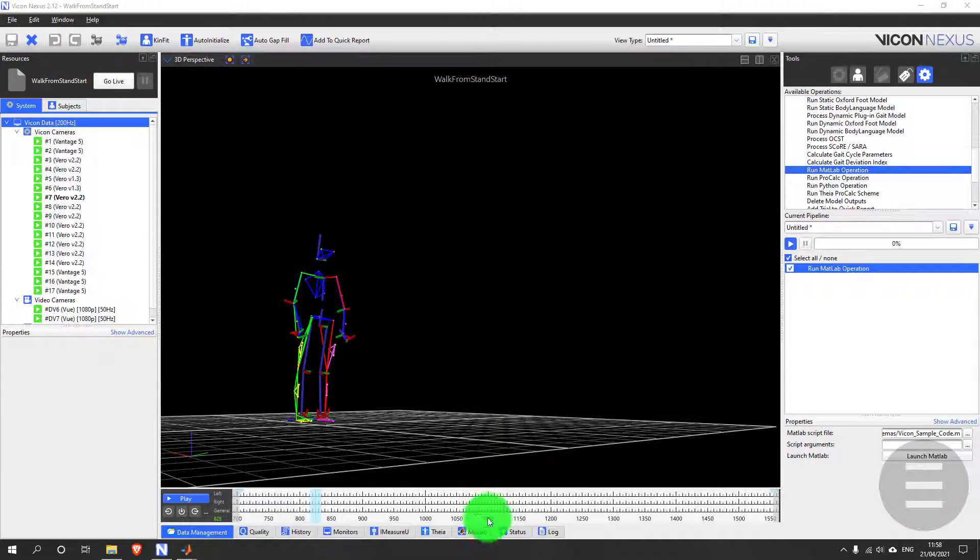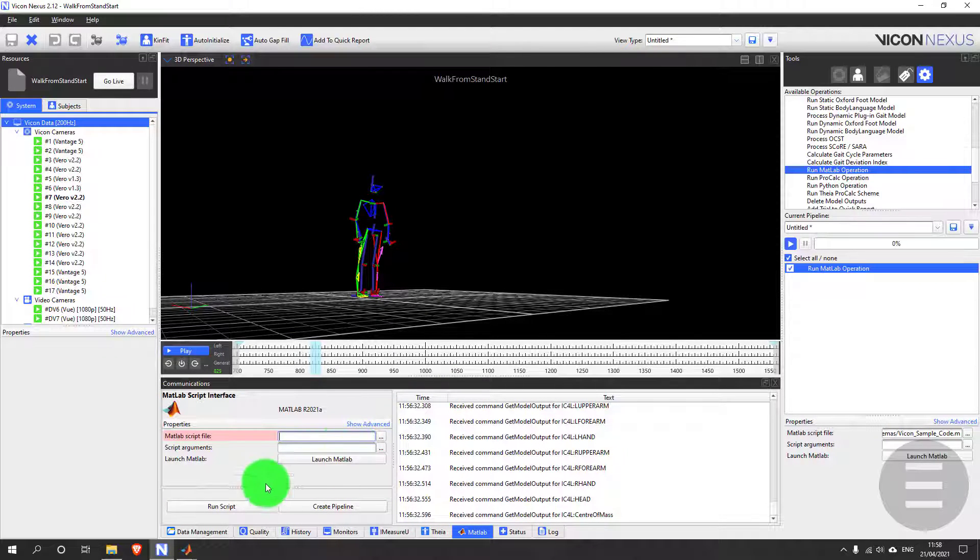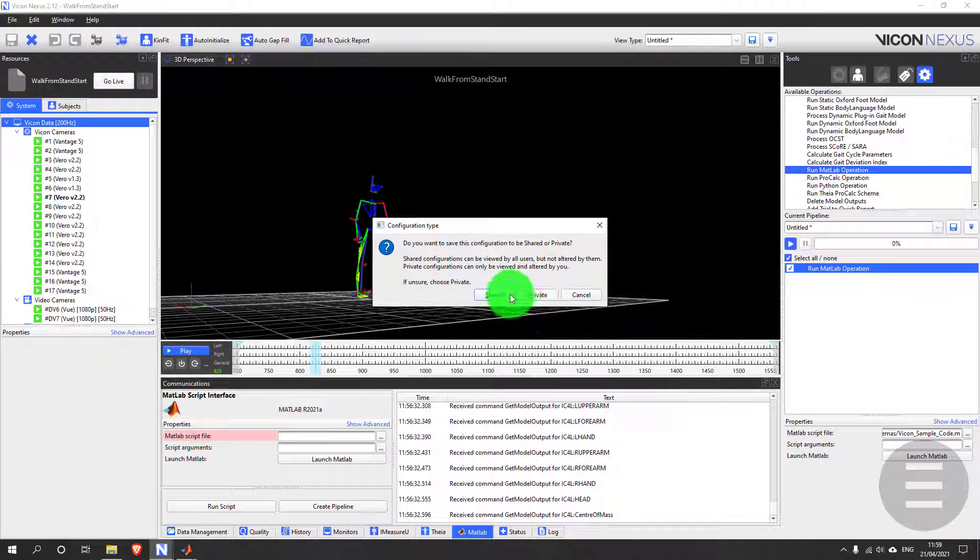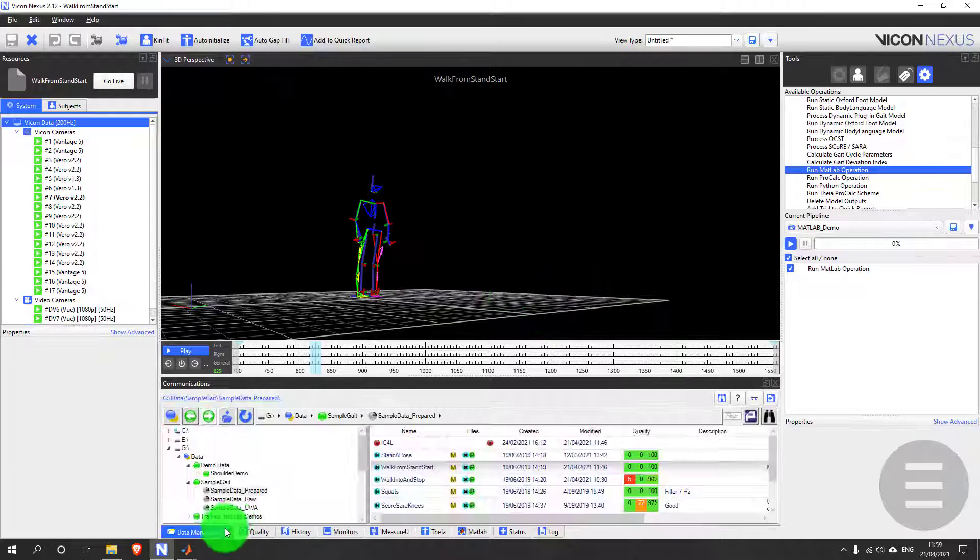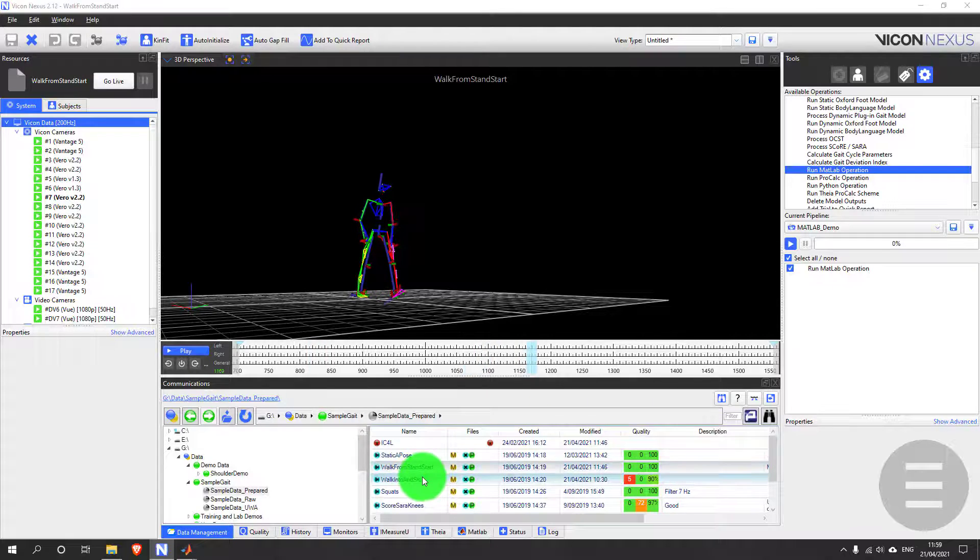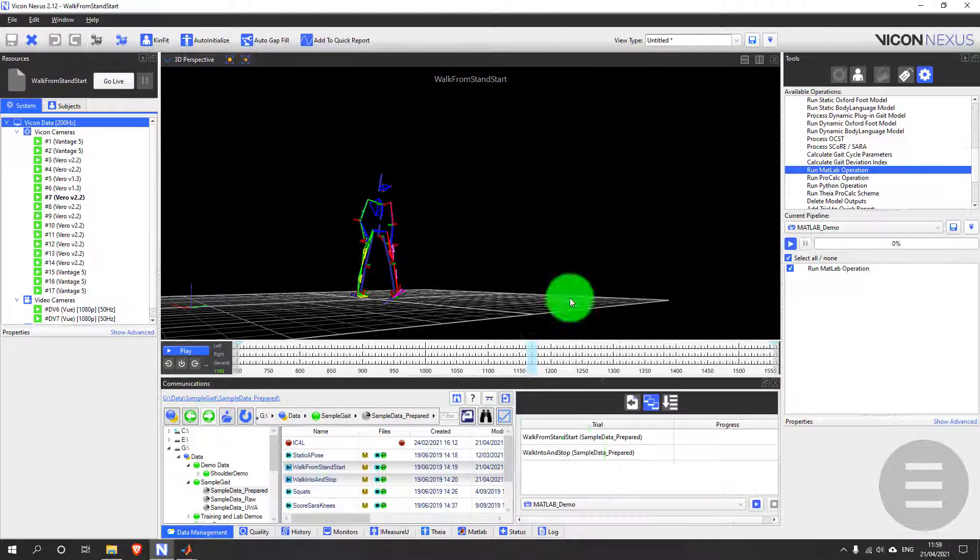Now in the Nexus interface I can run this using the MATLAB tab in the communications panel, or I can set up an operation, point it to my script and save a pipeline. Once it's saved as a pipeline, I can then use batch processing to quickly process all of the trials in my session.